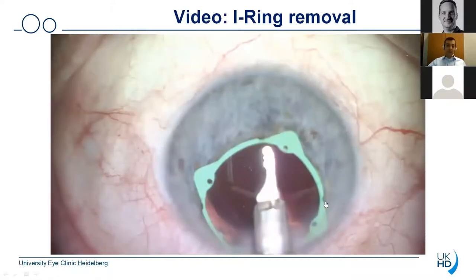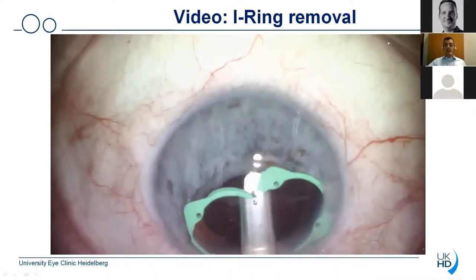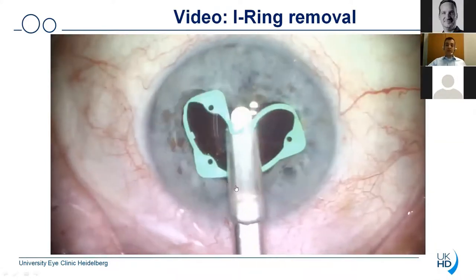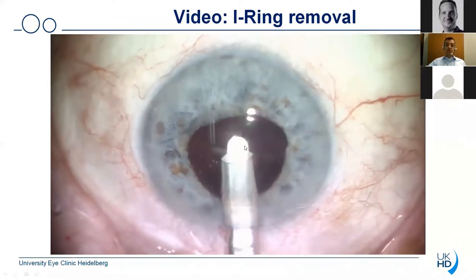So let's have a look at a surgical video where I remove the eye ring. You already see that the inserter with the prongs released is already in place and you can see the area where I will then grasp the eye ring. I have to make sure that I don't grasp the iris tissue. When you use this one-step technique you will notice that the eye ring flips in the eye, but it's so gentle a device that there's really no harm done to any ocular tissue.